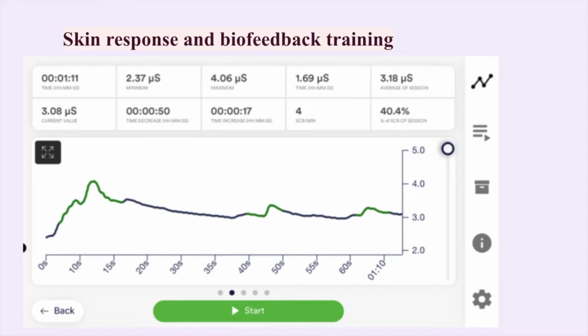So it's just saying that eSense skin response is not a medical device, and you shouldn't be using this to treat any of your undiagnosed ailments. Skin response is a precision device. It can measure the smallest changes, which it would be impossible to recognize yourself.